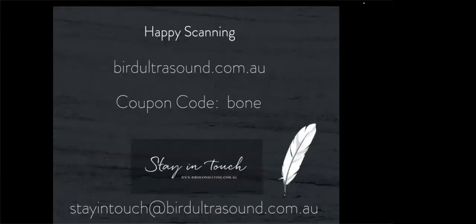I hope you've enjoyed this presentation. I think this is a really nice way of thinking about how energy is dissipated during an inversion injury to the ankle and the patterns that develop and the method to go about assessment of these patients.